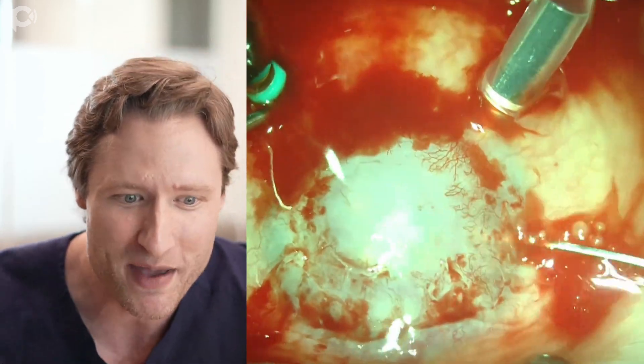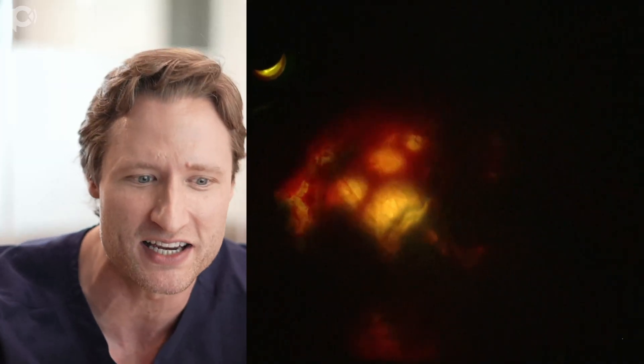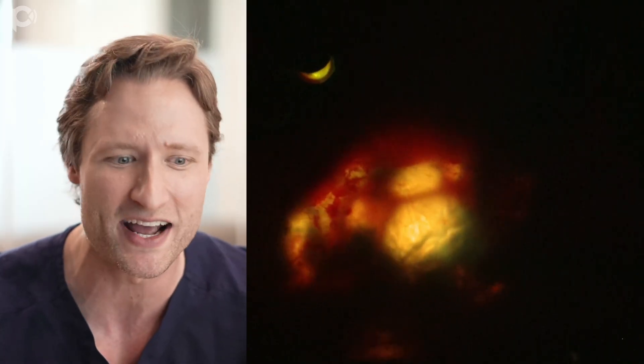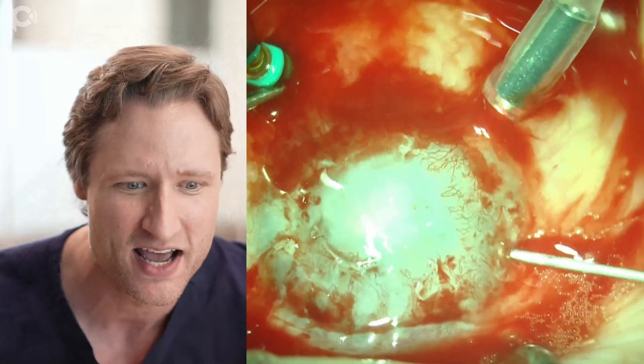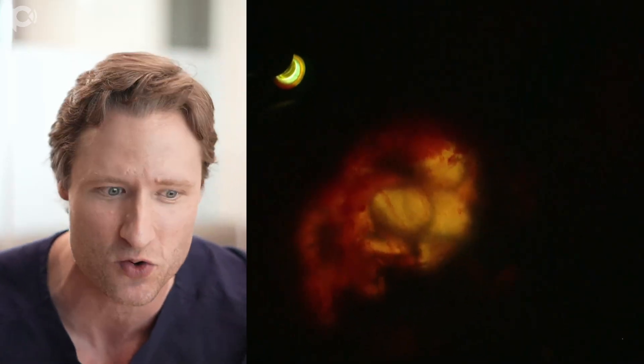I'll make a couple of extra paracenteses and go around bluntly dissecting to figure out what's going on with this iris tissue. It's in shreds - this tattered, irregular, wadded-up mess. And you can't leave that. There's no way you can unfold the DMEK graft in the presence of all of that.